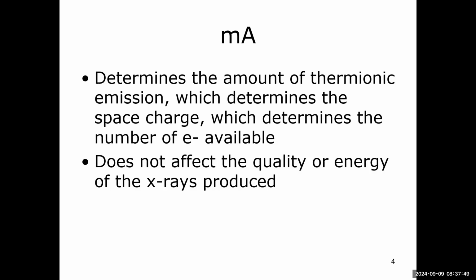However, the current, or the MA, does not affect the quality or energy of the x-rays produced. It only affects the quantity, the number. It doesn't change anything about their quality. And when we talk about quality, we're talking about the penetrating ability of that photon. How energetic is it?